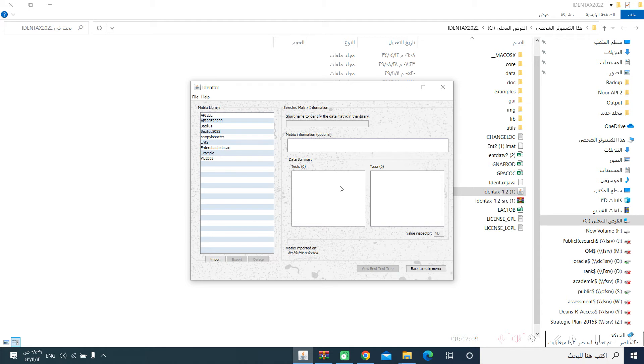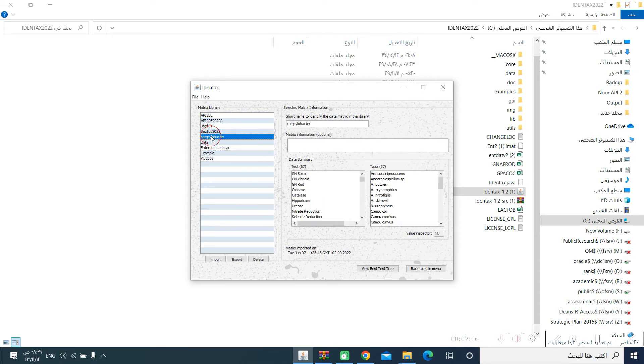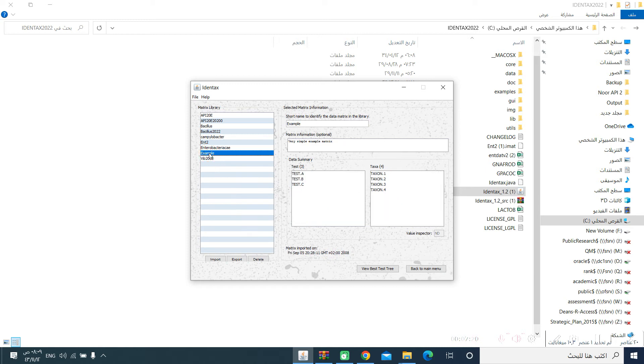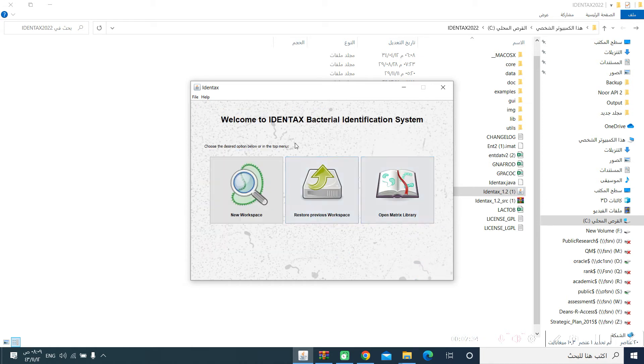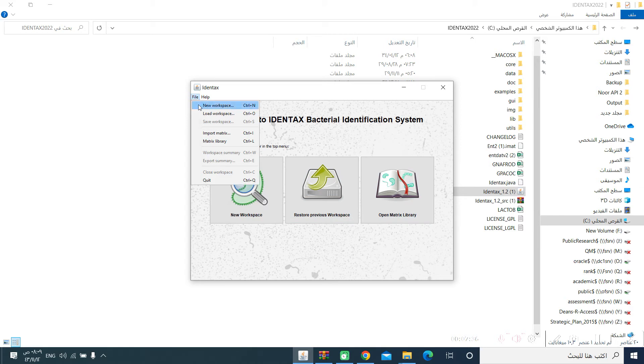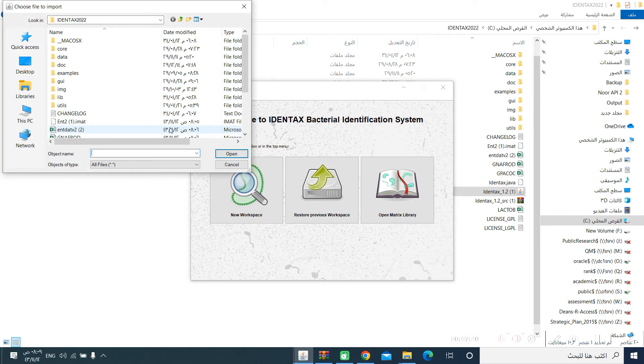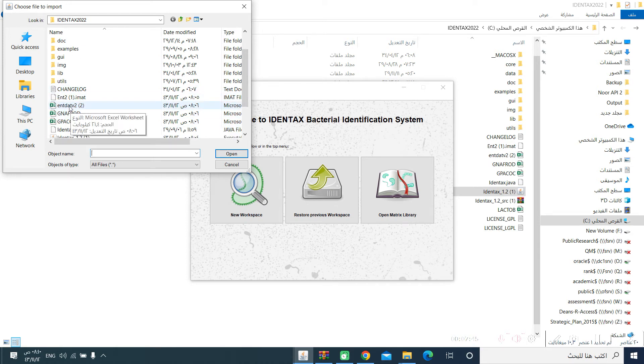Of course, I have many libraries installed in my computer before. But when you operate it for the first time, you will find only this one, which is the example library, which has nothing. So you have to import new libraries and we will show you how to import these libraries. Back to main menu, File, Import matrix.